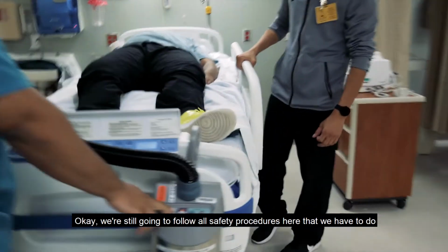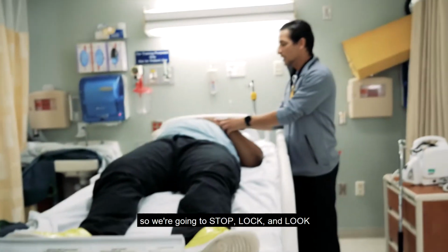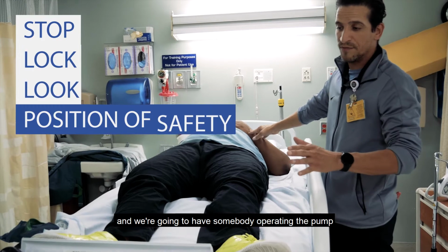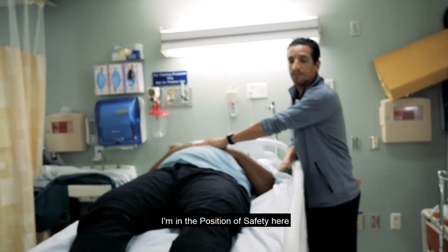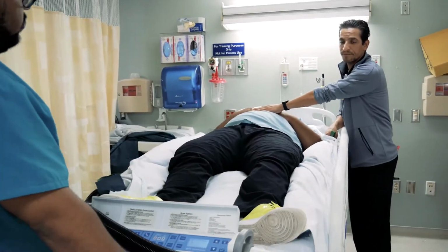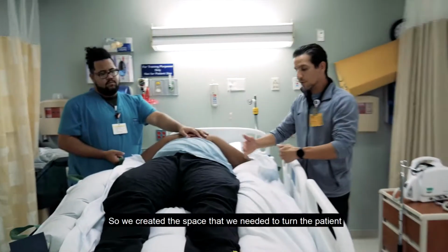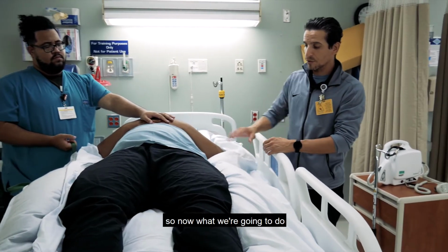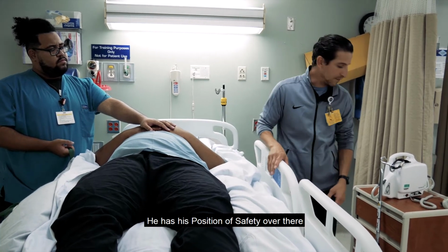Okay, we're still going to follow all safety procedures here that we have to do. So we're going to stop, lock, and look. We're going to have somebody in a position of safety, and we're going to have somebody operating the pump. I'm in the position of safety here. So we created the space that we needed to turn the patient. So now what we're going to do, we turn the pump off. He has his position of safety over there.